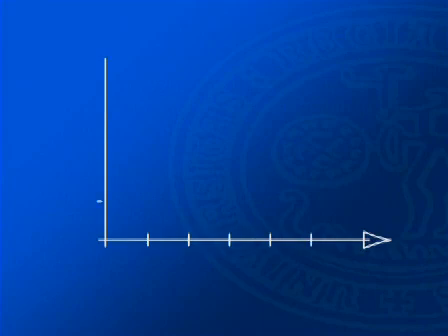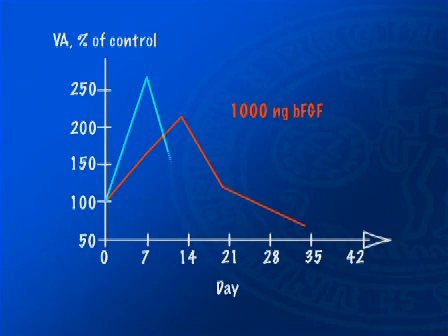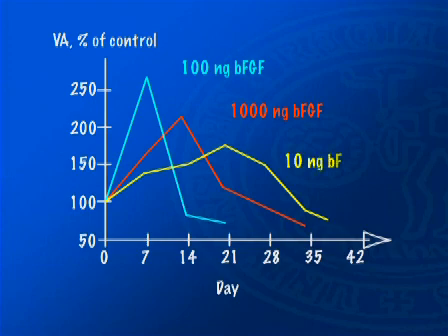The mesenteric window angiogenesis assay is well suited for dose-effect studies and for angiogenesis kinetic analyses. This can be done by treating groups of animals with different doses of pro-angiogenic factor and sacrificing these animals at different time points during the angiogenic response. The expansive phase, the peak, and the subsequent angioregressive phase can thereby be discerned in quantitative terms.